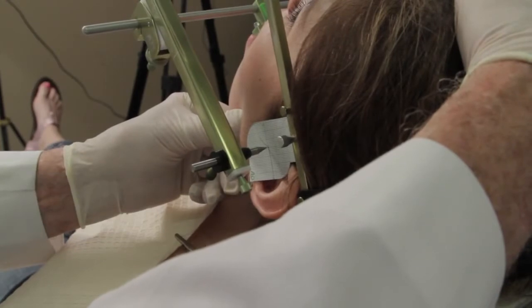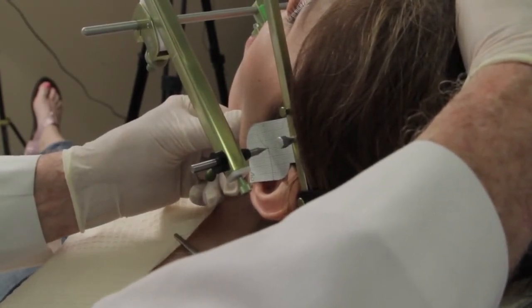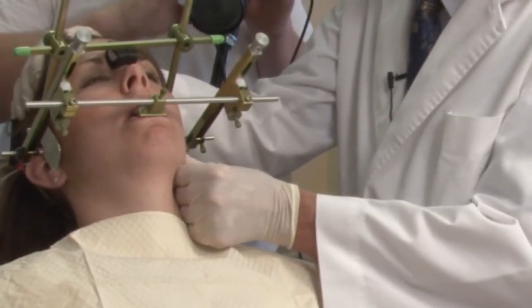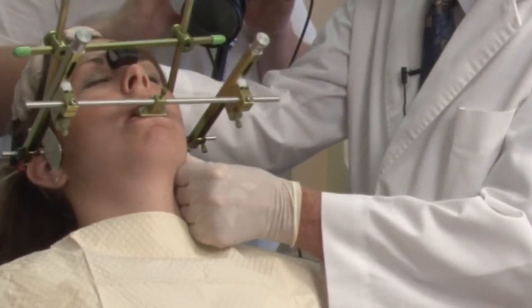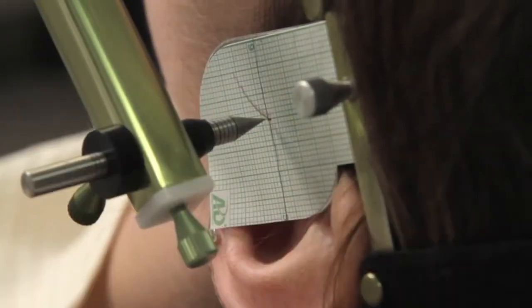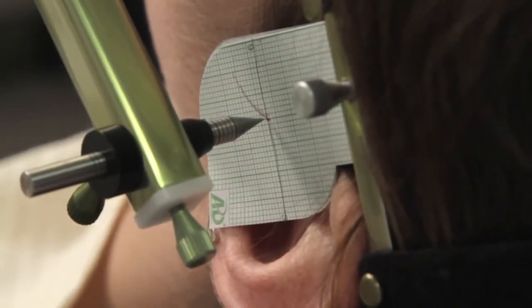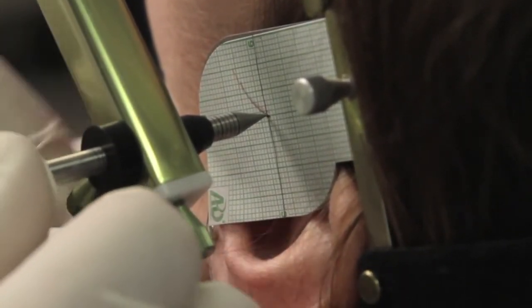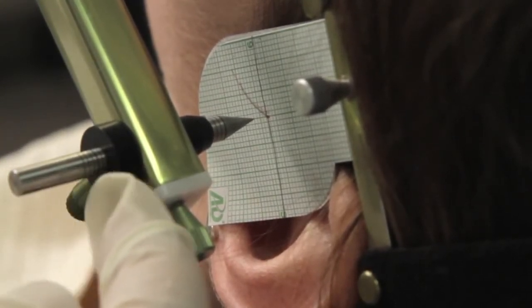At that point we'll move about 3 to 5 millimeters, going in this instance to the right, and when she's doing that I will put pressure on the ramus, pushing to the right and slightly toward the right joint. And as we do that, we'll then be measuring the immediate side shift by looking at our stylus pen. There are 2 ways we're going to measure. One is I'm going to use the stylus pen itself so that I'll look at the millimeter measurements here.